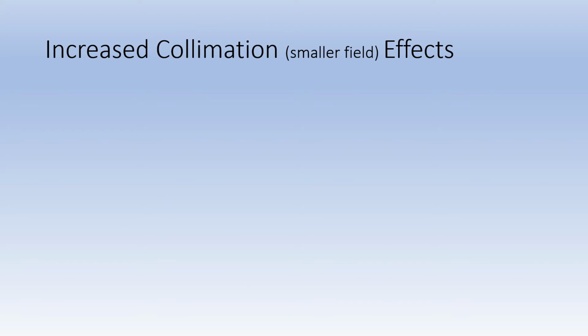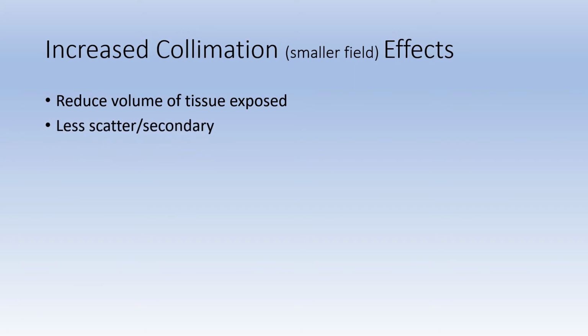The primary protective effect of collimation is that it restricts the volume of tissue exposed to the primary beam. This can make a significant difference for sensitive tissues or organs like bone marrow, reproductive organs, or even the thyroid gland. Scatter degrades the image and contributes to a higher dose. Fog contributes to a significant loss of contrast that the computer needs to differentiate tissue boundaries. This loss of contrast can contribute to a loss of visibility of detail.